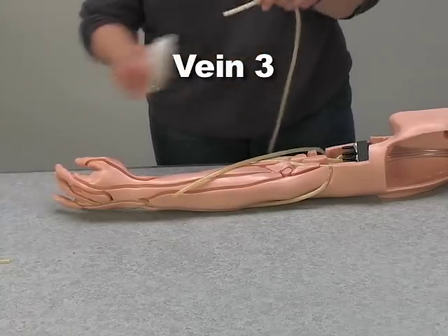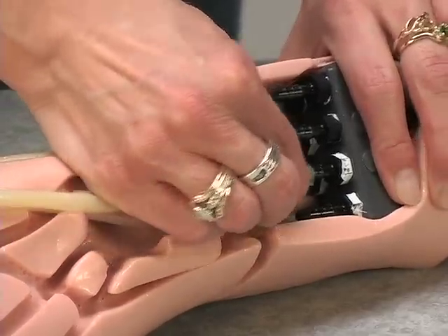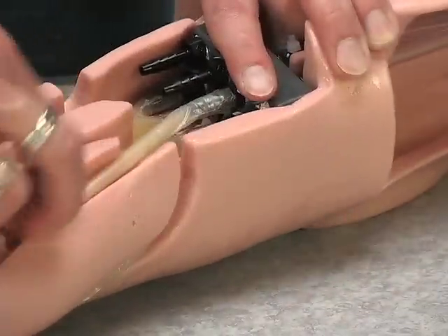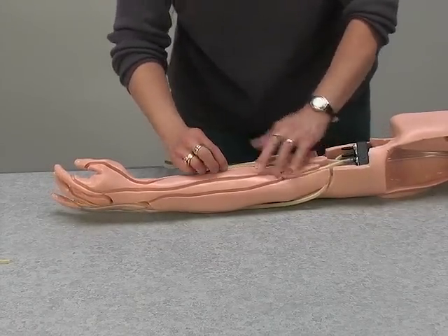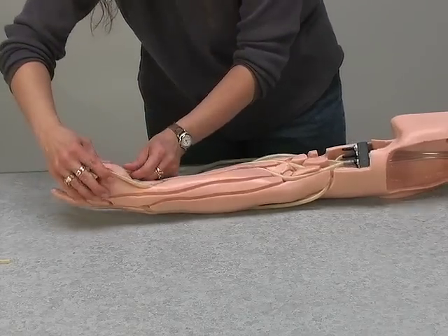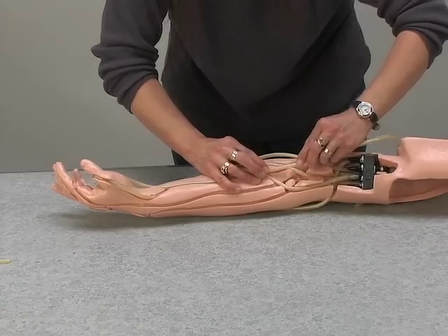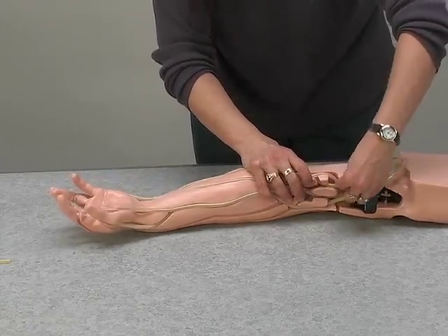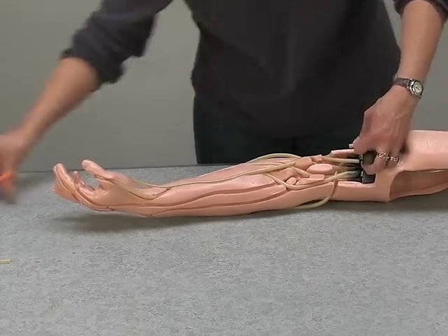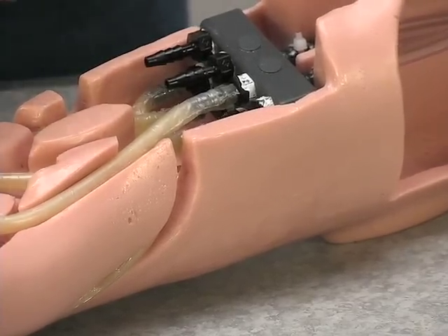Take the third replacement vein, lubricate, and connect to fitting number seven. Work it into the channel down the forearm, around the palm side of the thumb, and back to the end and toward the connector block in the same channel. Pass the vein over the first section of tubing and the second section. Cut the vein to fit, lubricate, and connect to fitting number five.